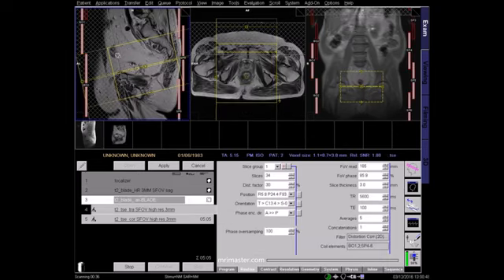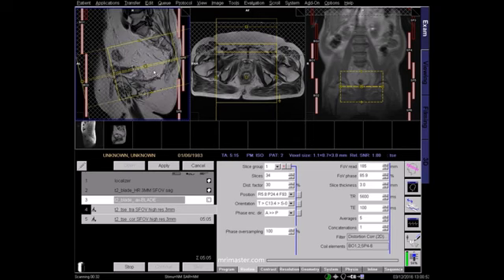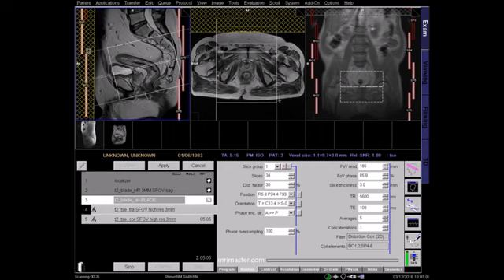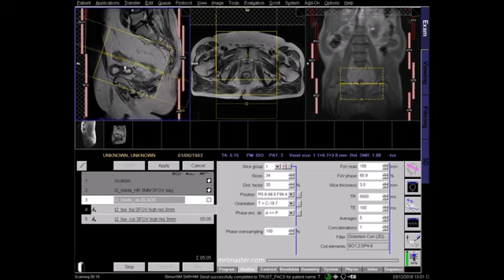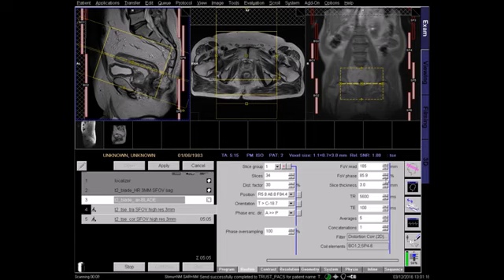On the T2 sagittal sequence, scroll through the image to find the area of interest in the rectum, as you'll need to plan your slices through the pathology. While scrolling, trace the extent of the cancer and notice its angulation. Plan the T2 axial perpendicular to the lower rectum. Ensure coverage of the presacral space and, if necessary, increase the FOV.